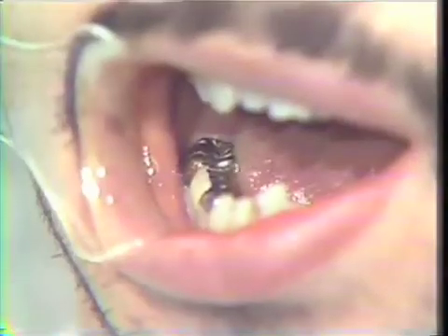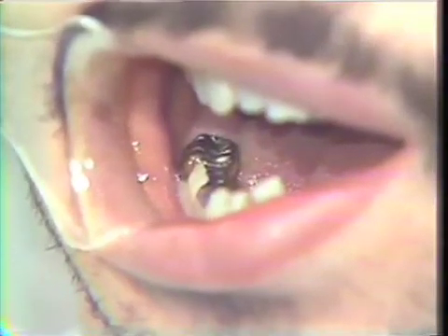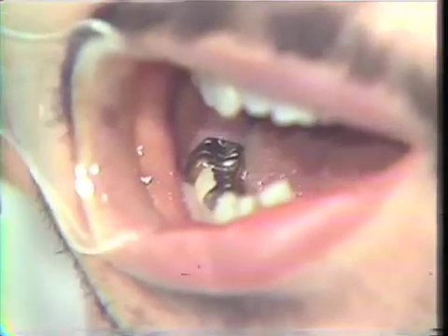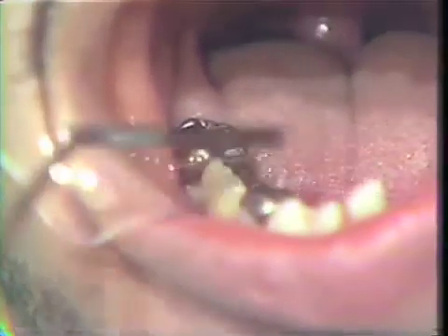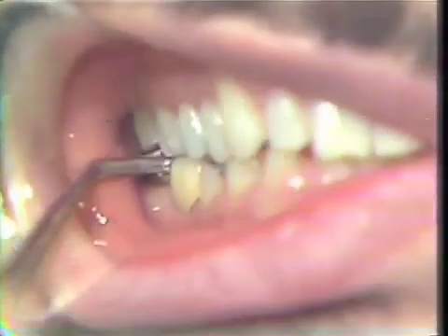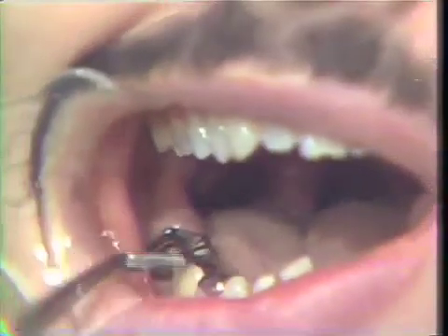Now place the bridge into the patient's oral cavity, and we will check with shim stock to ascertain where our centric contacts are. And as you can see, we have a facing on the pontic, and we'll have the patient close together, please. Bite together, please. Fine. In centric occlusion. Open, please. Back together once more, please. Good. We have contact there. Open again, please. Back together again, please.